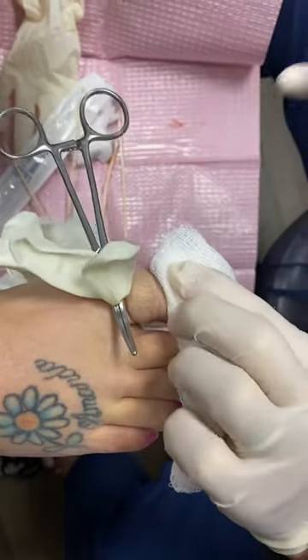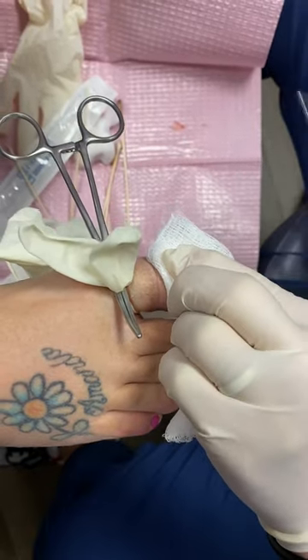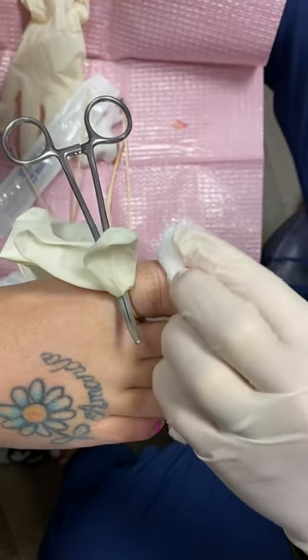We have a little tourniquet on here — we just use a glove, nothing fancy. We cleansed the toe with some rubbing alcohol ahead of time.